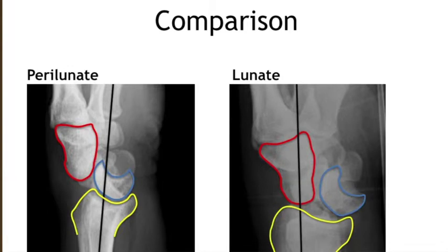And that is definitely an X-ray that you most likely will see on your board exam, so knowing the difference is extremely important, although both are treated the same and can be reduced in a similar fashion.